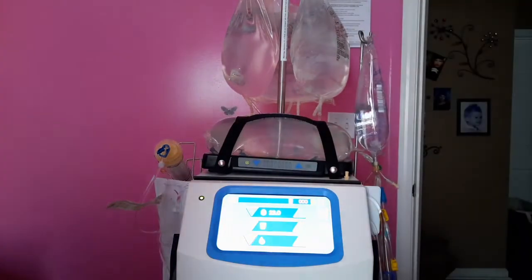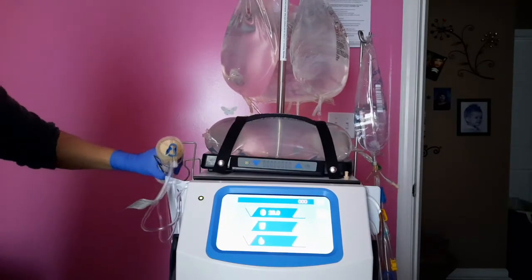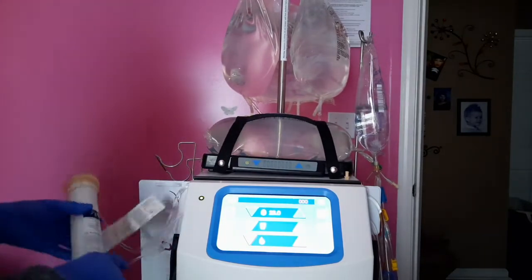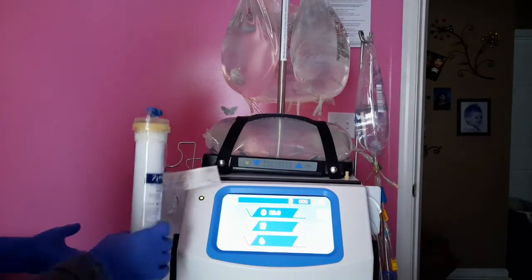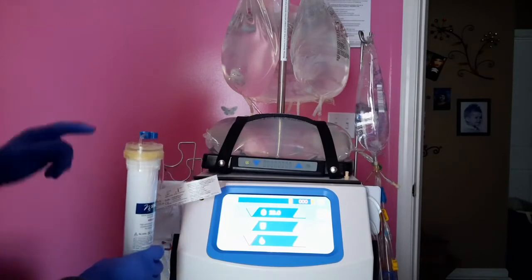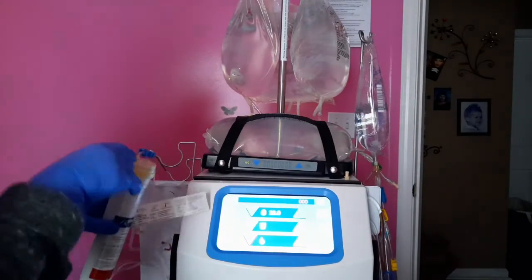Here's where we do something a little different. Okay, take the dialyzer out of its cradle. Alright, again, tap, tap, tap. Tap, tap, tap. Always looking. Tap, tap, tap. Alright, I see a little bit of air there.